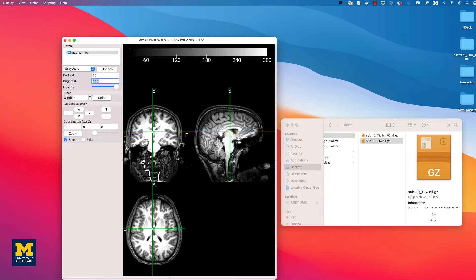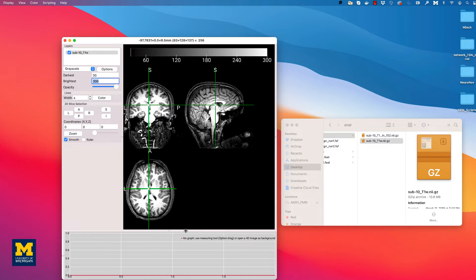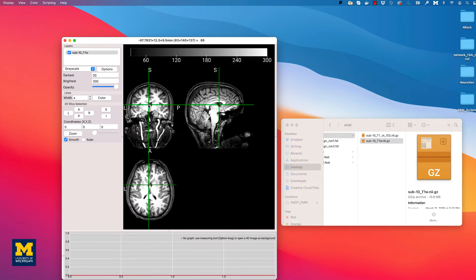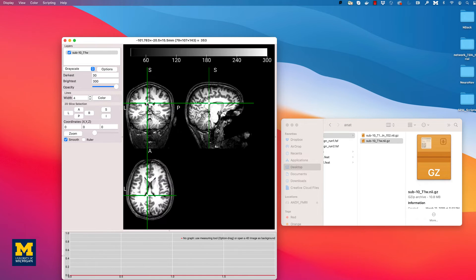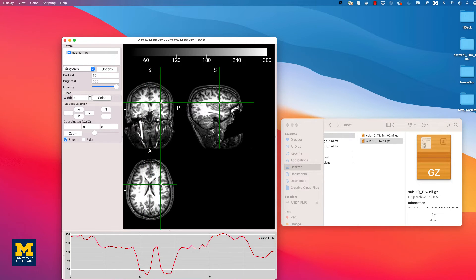One of the new features in MRIcroGL is the ability to visualize the changes in intensity over multiple slices. First, you will need to find the top of a hidden window pane at the bottom of the MRIcroGL viewer. Click and drag it up to see another window. Then, find an axial slice that clearly shows both of the lateral ventricles. Once you do, click somewhere in the left-hand side of the brain, hold down the Option key, and then click and drag the mouse to the right-hand side of the brain. You will see an intensity profile generated in the bottom window, depicting how the intensity changes over the slices you selected. Note that in this case there are two dips in intensity, indicating where the line you drew crossed over the lower-intensity ventricles.